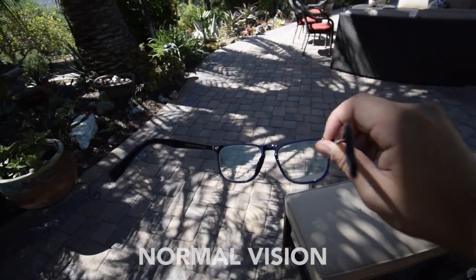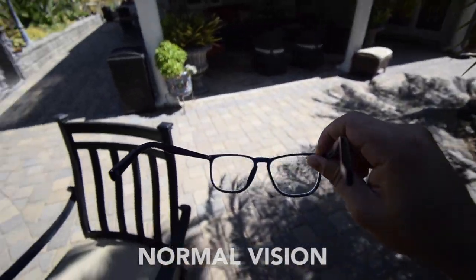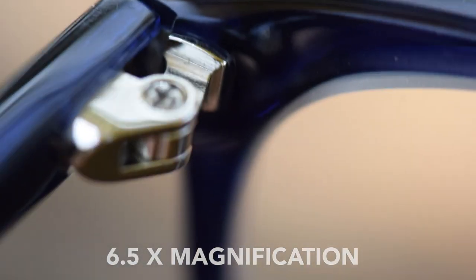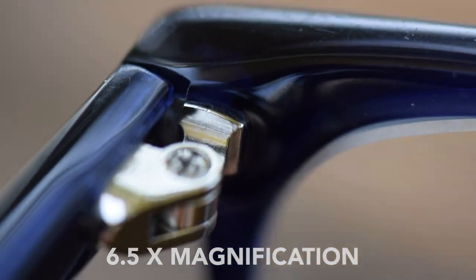To give you an idea of how zoomed in we're talking about, I set up a couple of shots focusing on my pair of eyeglasses. The first clip represents what we see with our eyes, and the next gives you an idea of what we see at 6.5x. Yeah, it's pretty detail-oriented.